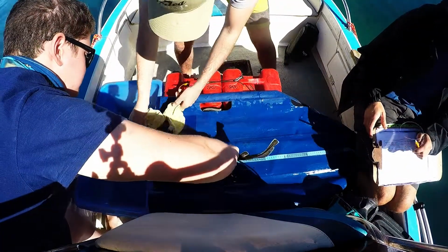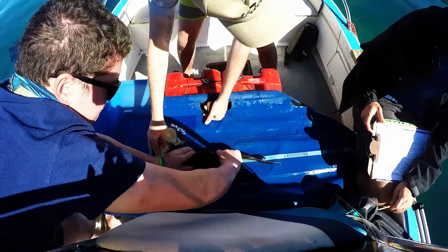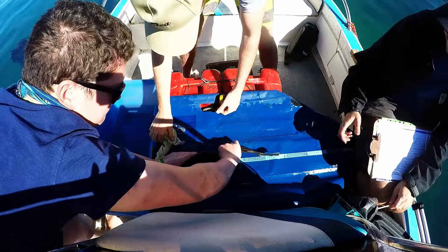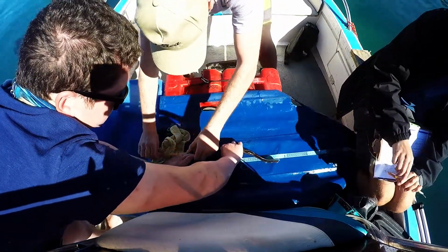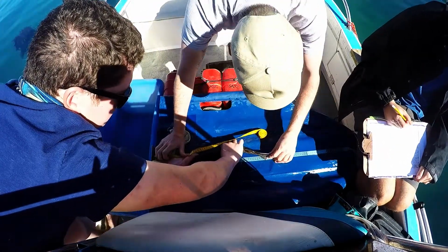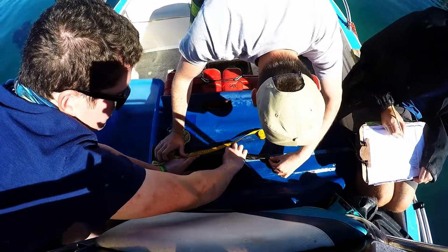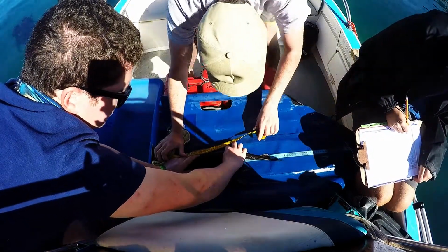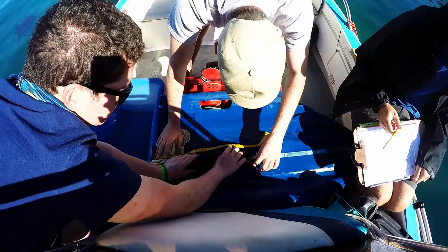Once the shark is secure on the mat, it is advisable to place a wet cloth over its eyes to minimize stress. 3 measurements are taken from the shark. The total length is measured from the tip of the rostrum to the tip of the caudal fin. The precaudal length is measured from the tip of the rostrum to the start of the caudal fin. The interdorsal length is the distance between the end of the first dorsal and the start of the second dorsal fin, although this measurement is species specific as not all shark species have 2 dorsal fins.